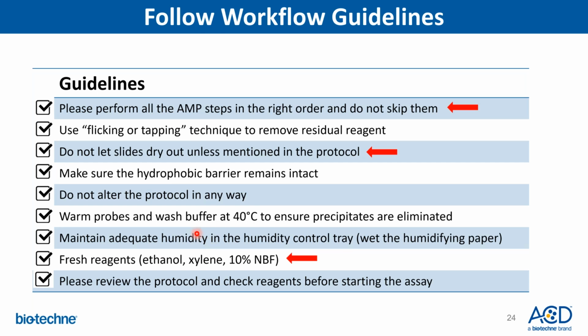The other point that is also important is that you follow the workflow guidelines carefully. Some of the important ones would be, as I mentioned earlier, make sure you perform all the amplification steps in the right order and do not skip them. Failure to do so will result in no signal detection. Make sure you don't let your slides dry out unless it is mentioned in the protocol. And it is recommended that you use fresh reagents such as ethanol, xylene, or 10% formalin all the time. So these are some of the workflow guidelines.